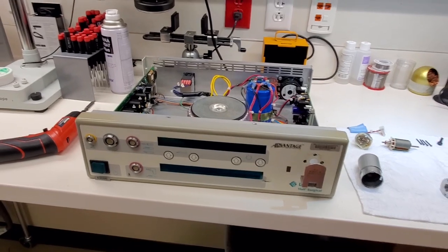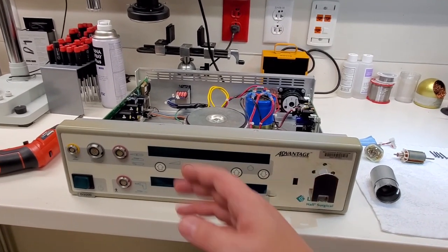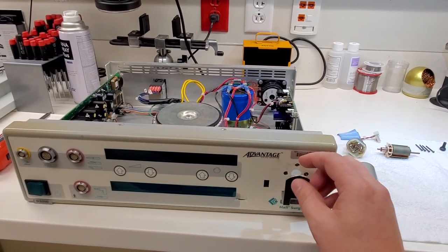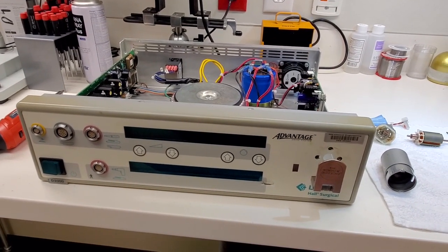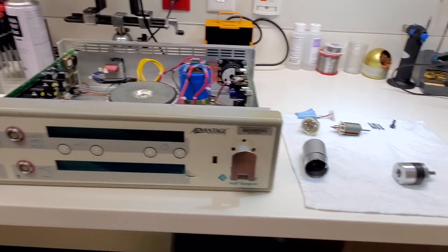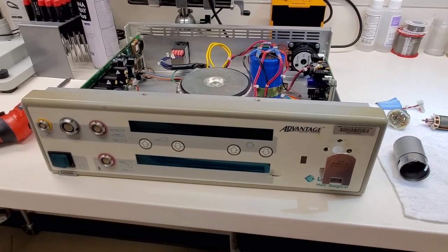This is a Linvatec D3000. It's a shaver slash motor handpiece for orthopedics with an irrigator. The customer brings it to us with the complaint that when they activate the handpiece, the irrigator doesn't work. So we took it apart just to see what's going on.